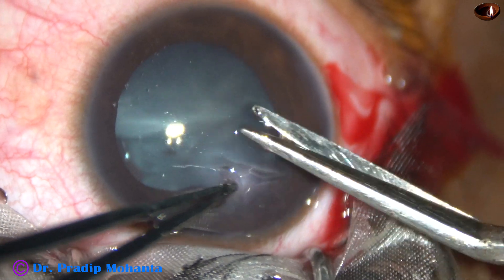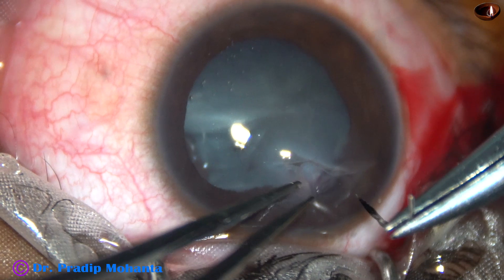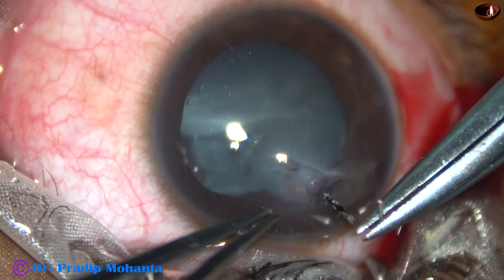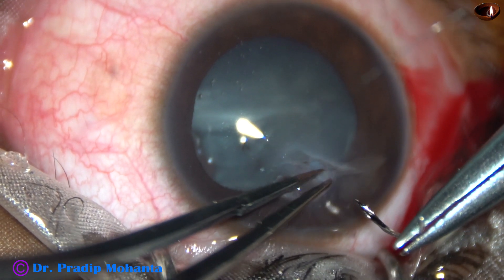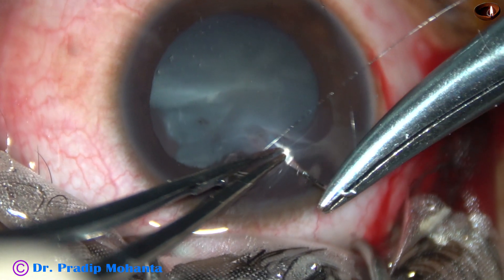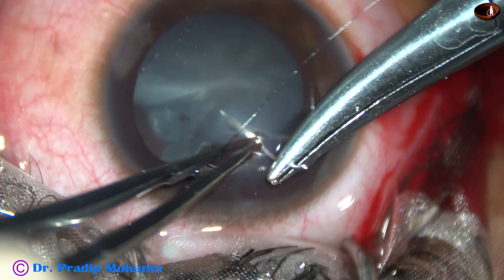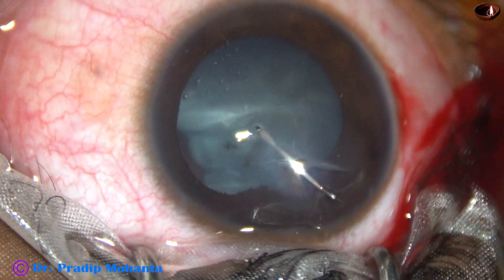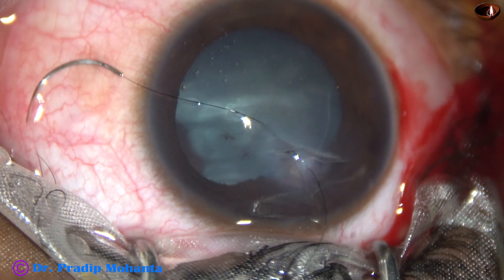In this view we can see the gap at 2 o'clock. The vitreous strands have been removed. This is the first suture — this is a triangular corneal laceration caused by the beak of a bird. This is the first suture from the apex of the triangular corneal flap.